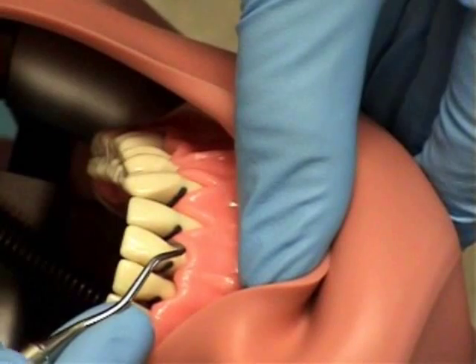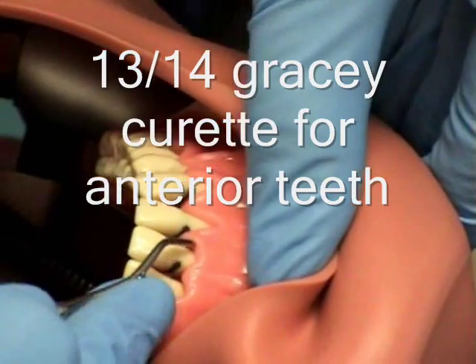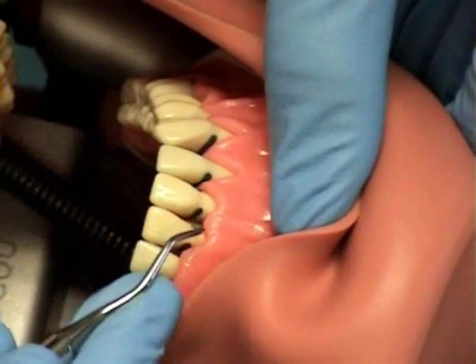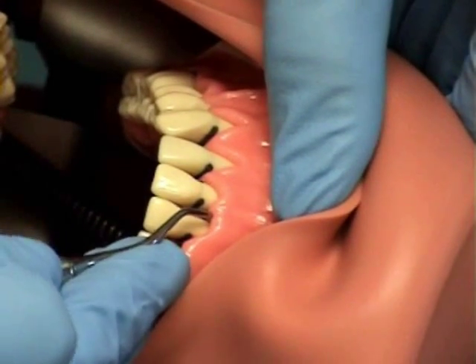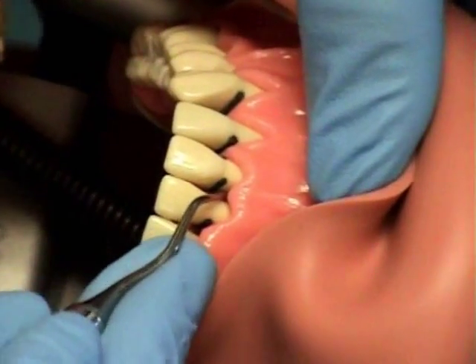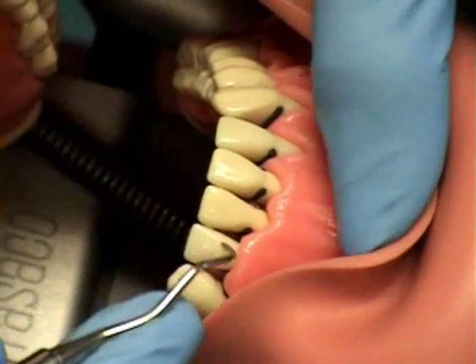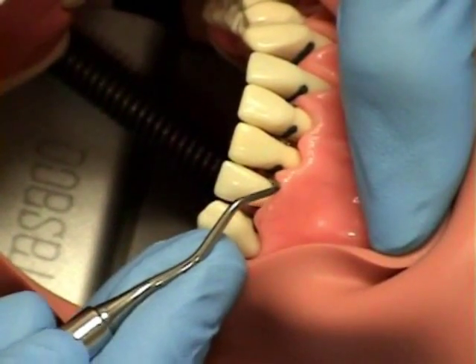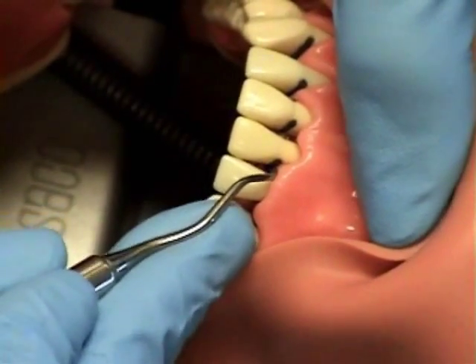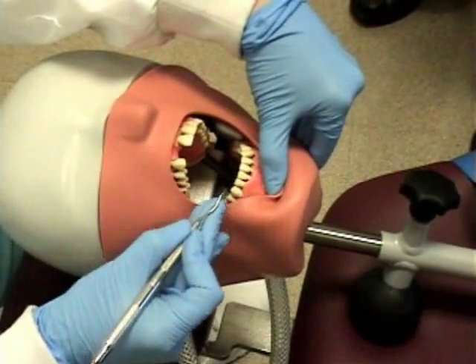One of our best kept secrets is that a 13-14 curette can be used in the anterior. If you notice, when you close the blade, you can insert it without causing tissue trauma. Open the blade so that the terminal shank is parallel to the long axis of the tooth. With your surfaces away from you, you must sit at 11 o'clock in order to adapt the 13-14 correctly. For the surfaces towards you, it's important to sit at an 8 o'clock position.